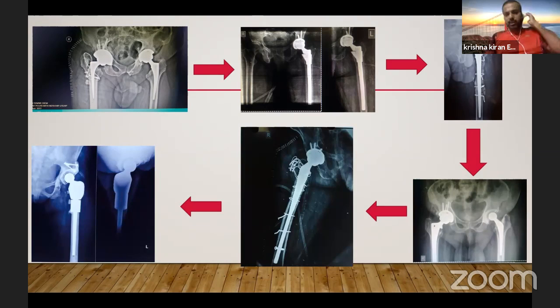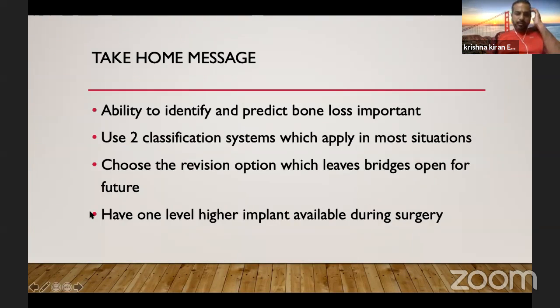So we should not forget this sequence: cement in cement, proximally loading modular stems, stem in sleeve constructs like SROM, the use of a monoblock Wagner stem, which is the workhorse for revisions in our hands. There is some role of porous coated as a salvage option in elderly people, or if you're more familiar using that. The use of either interlocked or non-interlocked modular stems, the proximal femoral replacement processes.